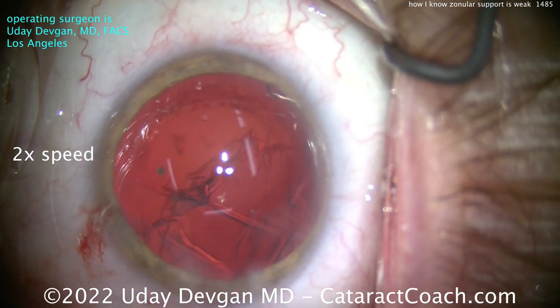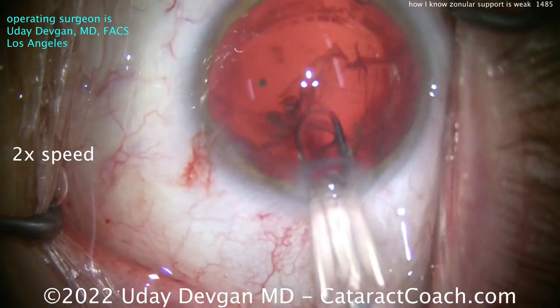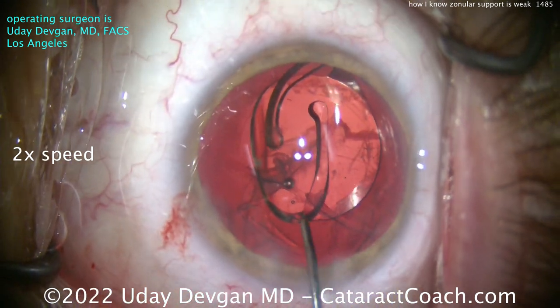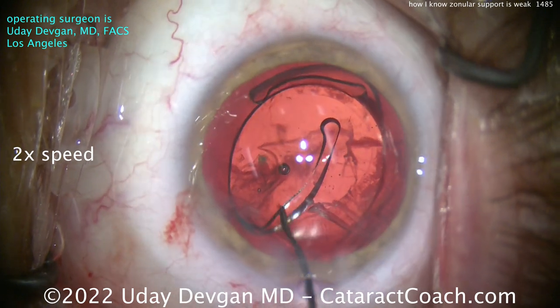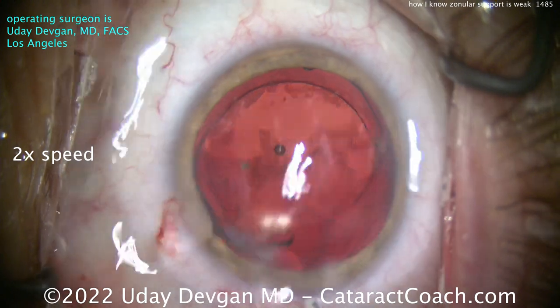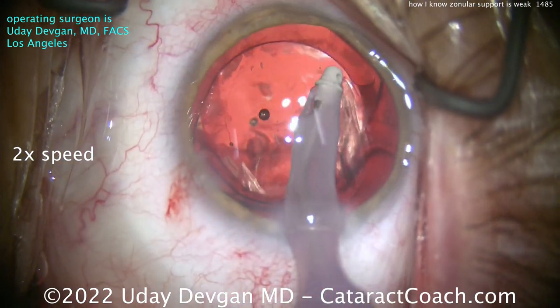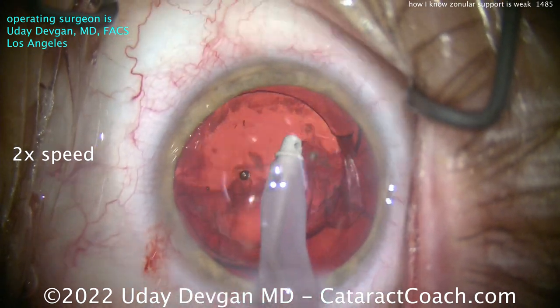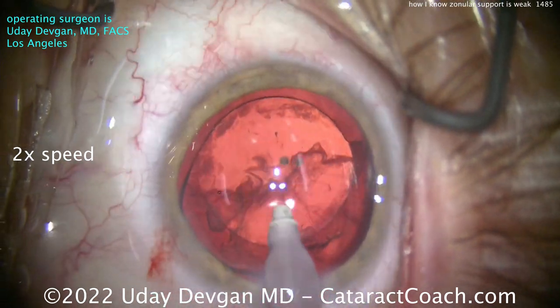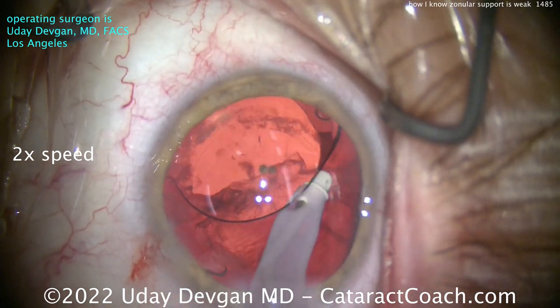Now removal of the cortex is going to be a lot harder. Let's first put the lens in — get everything done at once. You might say: what about the cortex, you can't leave that in there! You're right — if you leave that cortex, tomorrow morning it's going to be a big white fluffy mess and the patient won't see much. So I'll try to get it out here, doing a little removal of the cortex with the coaxial I/A tip. It works okay — I'm going underneath the optic, but I just don't have the access I want.